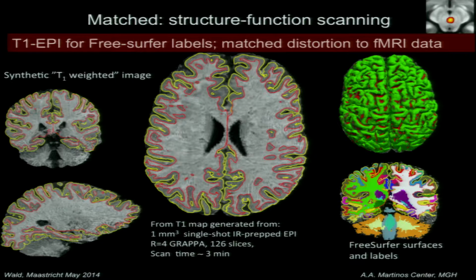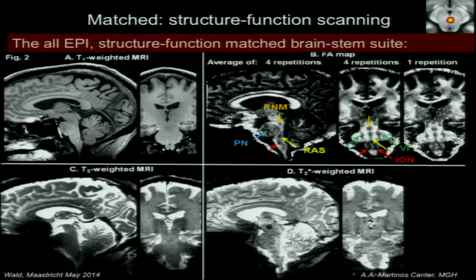And we simply synthesized the T1 weighting that FreeSurfer happens to like, which was based on basically a 1.5T scanner many years ago. We run the EPI through FreeSurfer and generate the surfaces now. Then we can rest a little easier at night knowing that those laminar surfaces are exactly distortion matched to the functional data. There's no sense stopping at T1.